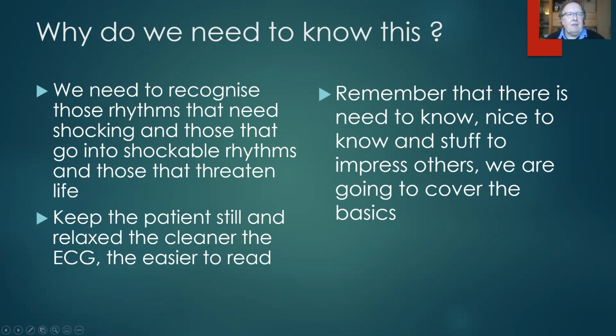Okay, so we need to recognize those rhythms that need shocking, those rhythms that go into shockable rhythms, and those that are life-threatening. Everything else is a bit of a bonus. For me, when it comes to reading ECGs, and I've been around for a very long time, there's need to know, nice to know, and then stuff to impress other people with. Yeah, so we're going to only cover the basics here. Important to keep your patient as still as possible and as relaxed as possible, because the cleaner the ECG, the easier it gets to read.